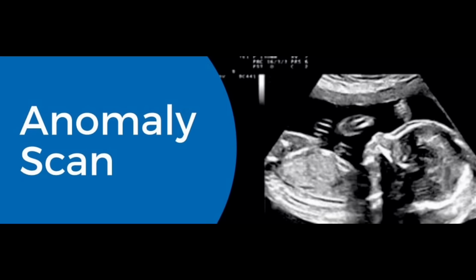Absolutely. And today we are taking a deep dive into one of the most significant applications of that technology, the fetal anomaly scan. A really crucial scan. It's a critical milestone in pregnancy, sometimes known as the second trimester anatomy scan, or TIFFA, that stands for Targeted Imaging for Fetal Anomalies. Right, TIFFA. You hear that term quite a bit.